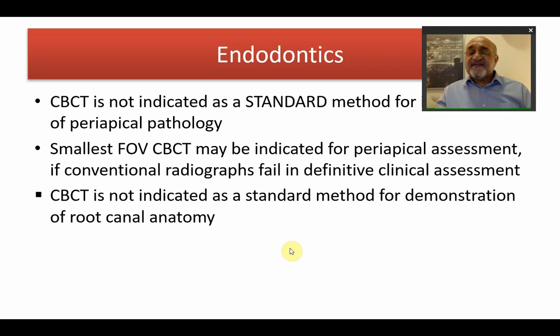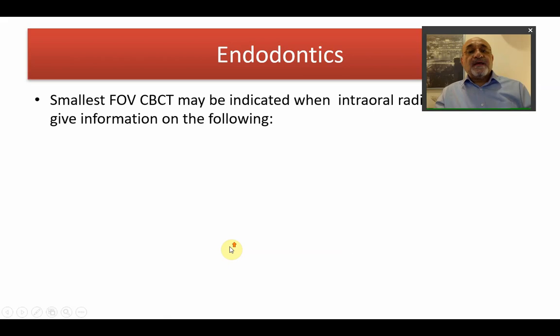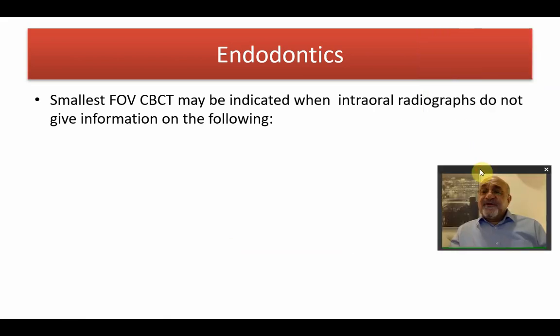CBCT is not the standard method of demonstration of root canal anatomy, because again root canal anatomy can be better felt with your tactile sensation with a small reamer or a file, and our endodontic colleagues are well aware of this fact. If you decide you will go for a CBCT, then choose, as we said, the smallest field of view.